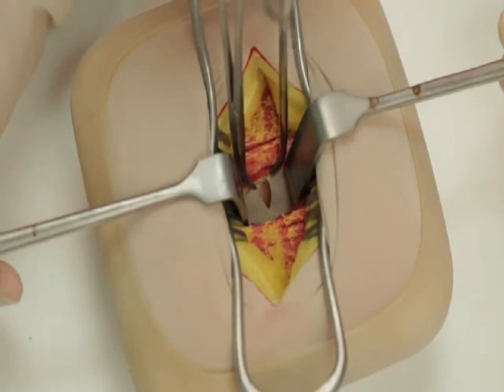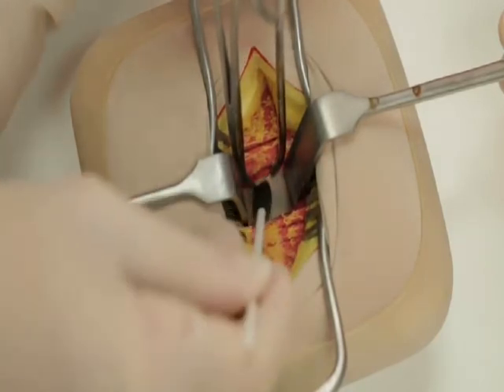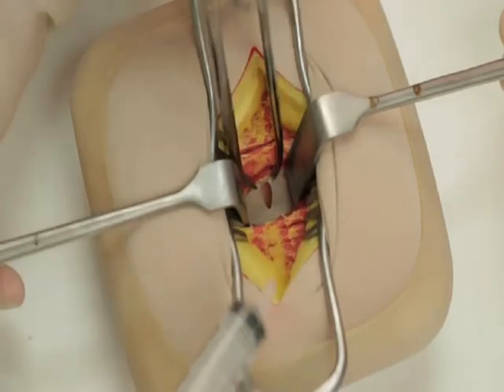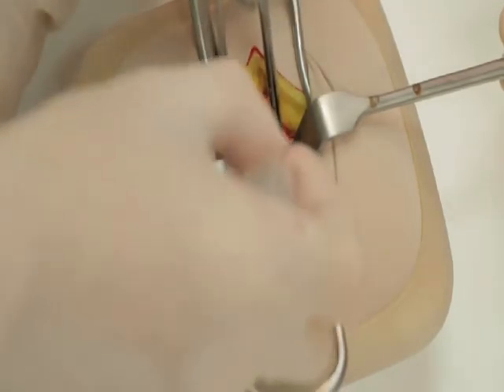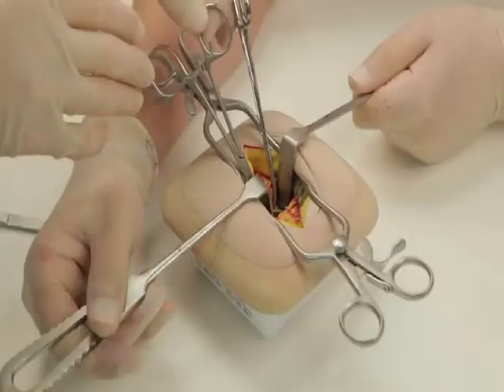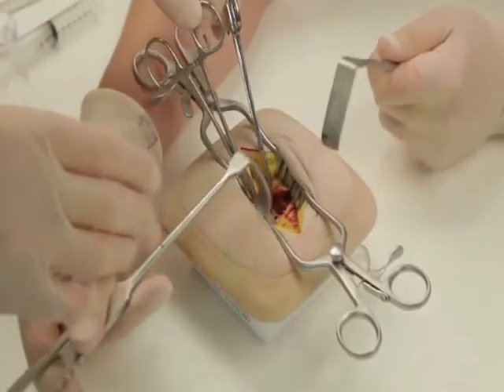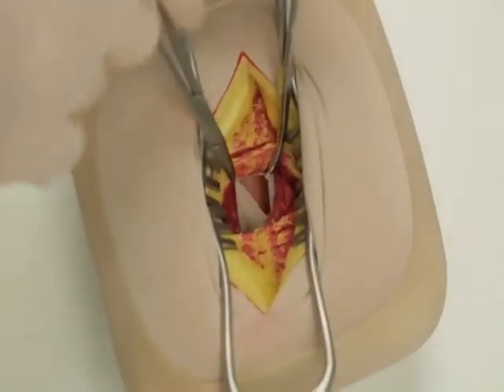If there is free fluid or pus, take a swab or alternatively collect the fluid using a syringe. Look for any bile-stained fluid which may indicate a perforated peptic ulcer. Identify the cecum via the taeniae coli and follow these to the base of the appendix.